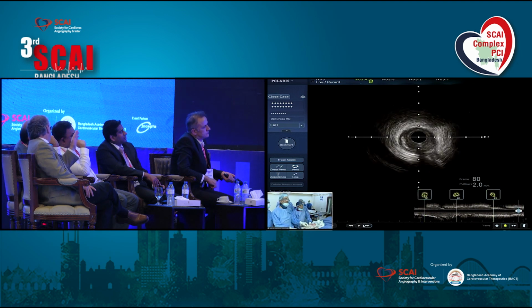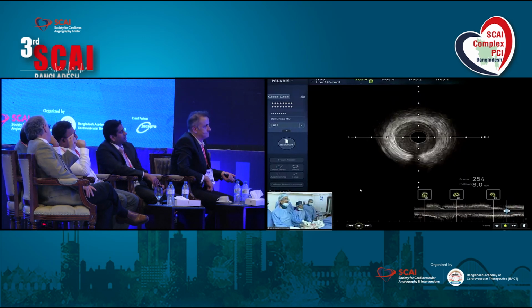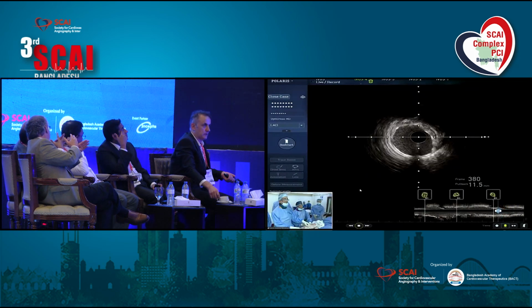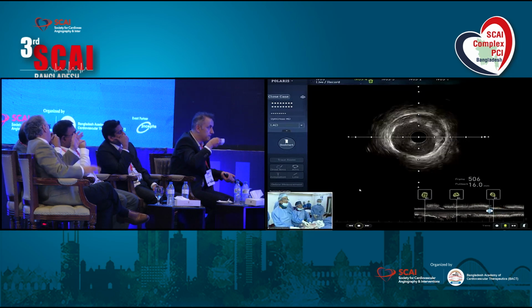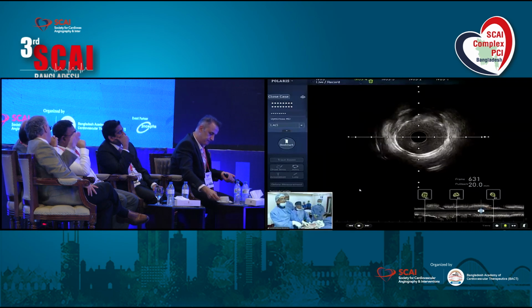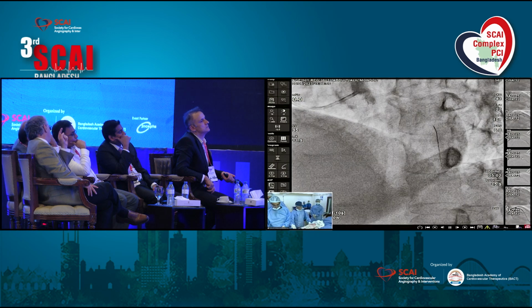Mr. Jamal, sir, would you like to take more data, an angio view of LAD? Yes, just by IVUS it is perfectly good. Okay, can you switch from IVUS? They're only seeing IVUS. I want to change the view. Oh, you would like to finish with IVUS only? Yeah, that is a good idea.